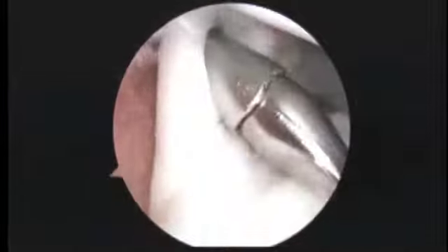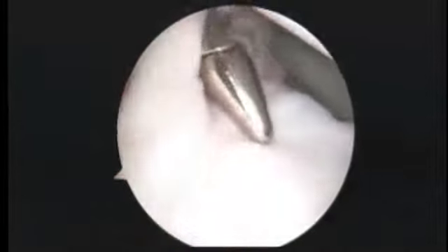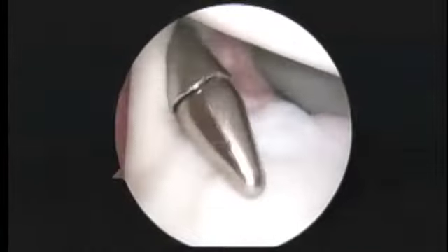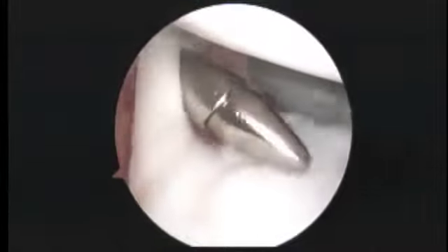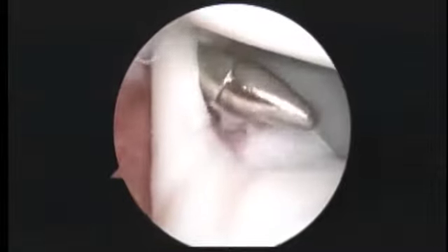Dr. Buford, we're just getting started on your right shoulder. Your shoulder was very unstable when we examined you under anesthesia, which is what we expected. And now we're just getting started with our first look inside. We're looking from the back to the front. We've got 2 cannulas coming in the front, metal one on the left, gray plastic one on the right.